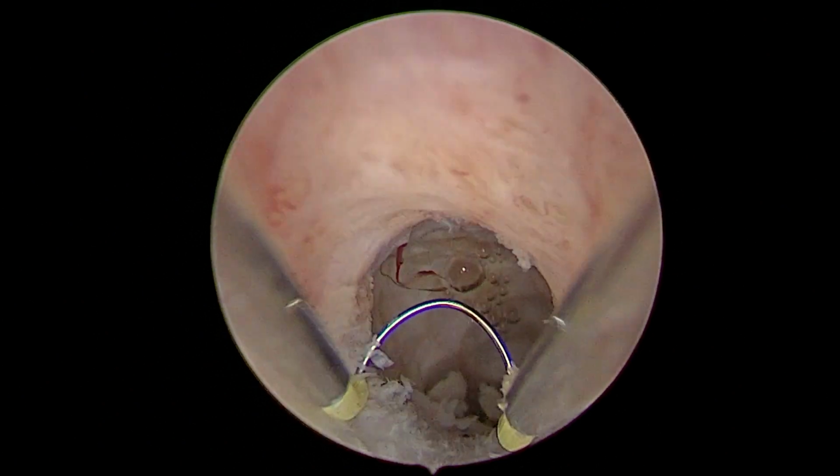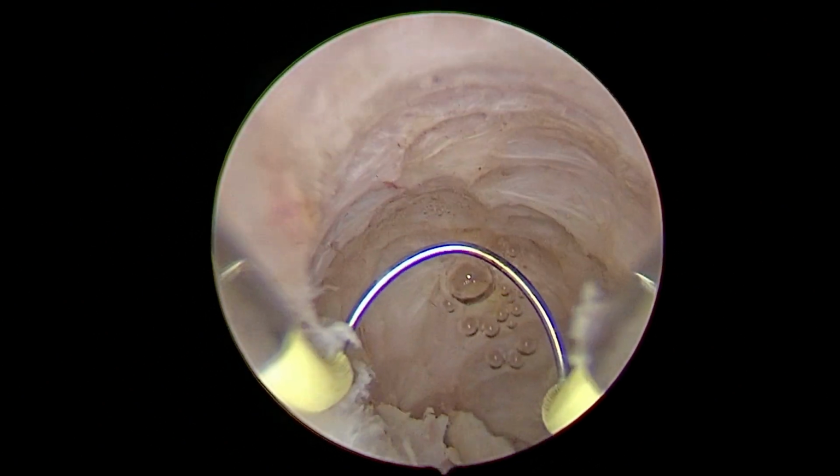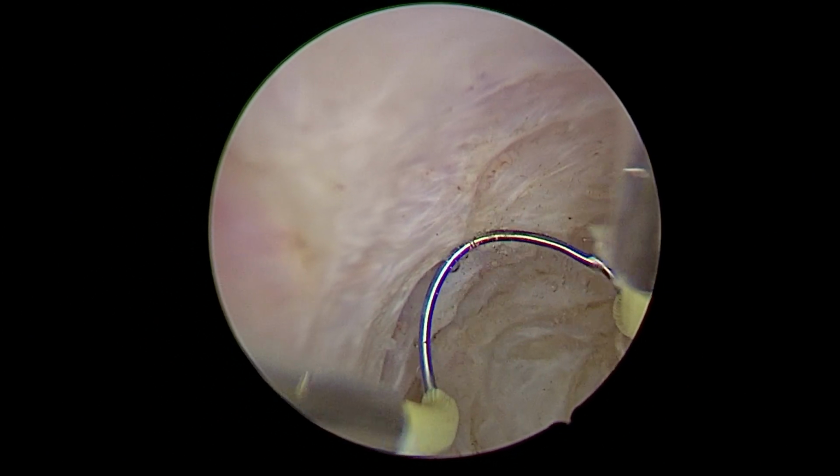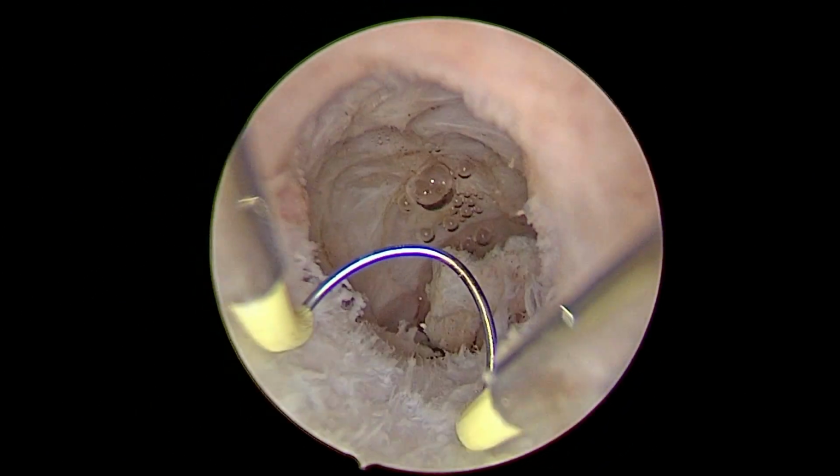So we come out and we can see that our entire surgery is complete. This is the last bleeder which is being taken care of.